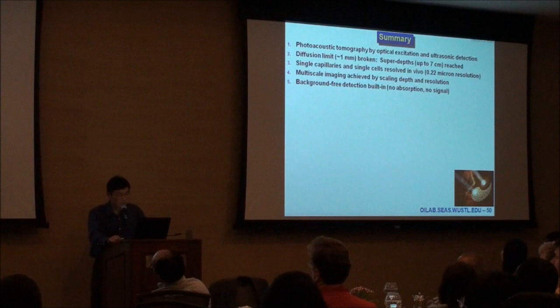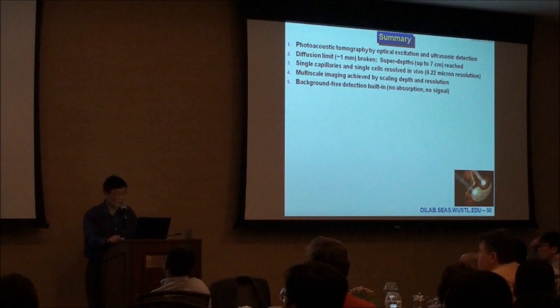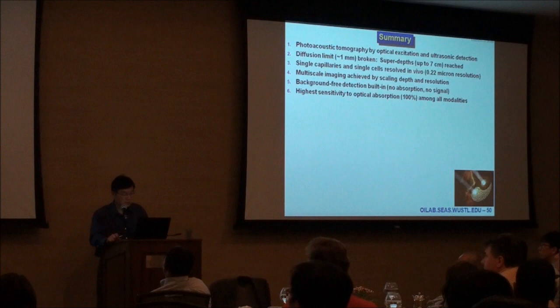Background-free detection is built in, so that means that when there's no absorption, there's no signal, which is the most ideal situation in engineering, as we know. You always want to have the background-free option if you have it. In fact, photoacoustics has the highest sensitivity to optical absorption at 100%. So that's the highest among all modalities.